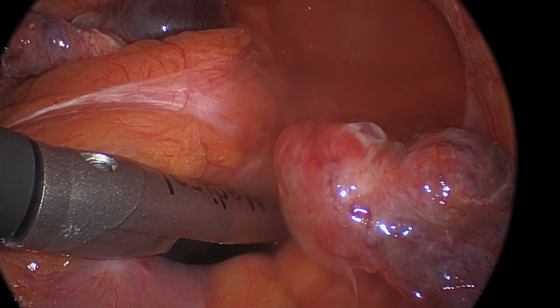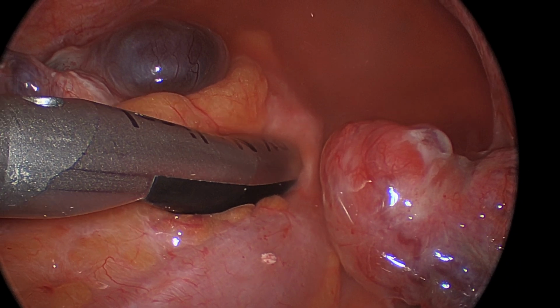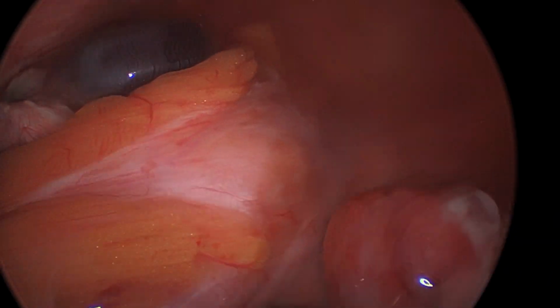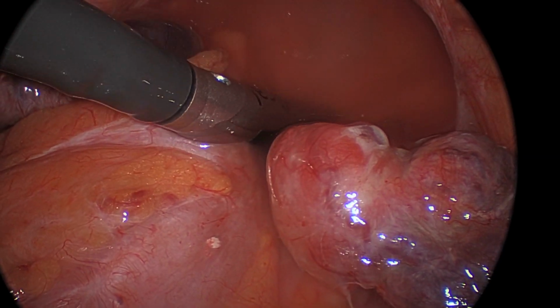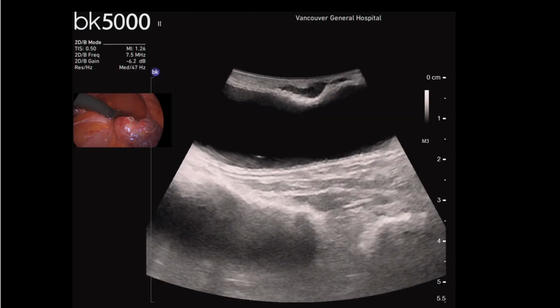The laparoscopic ultrasound probe was then placed in the region. The bowel was then traced until the lesion was clearly identified near the rectosigmoid junction. Intraoperative images provided in-time feedback highlighting the depth and extent of the lesion. Here there is evidence of the lesion extending into the muscularis of the rectosigmoid colon.